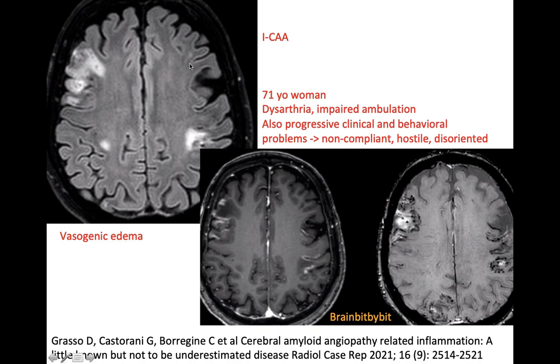This is a case of inflammatory CAA, where you can see on FLAIR areas of vasogenic edema — proven on DWI — with involvement of the cortex and subcortical white matter. There is enhancement of the leptomeningeals and microbleeds on the SWI, in this woman in her 70s presenting with dysarthria and impaired walking.